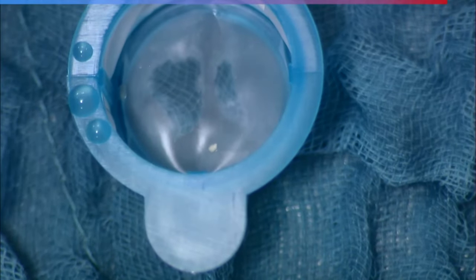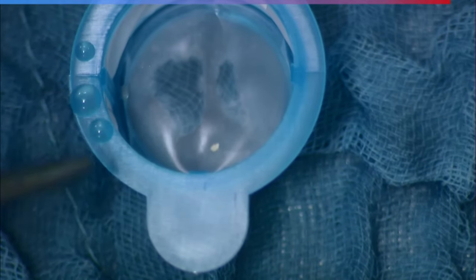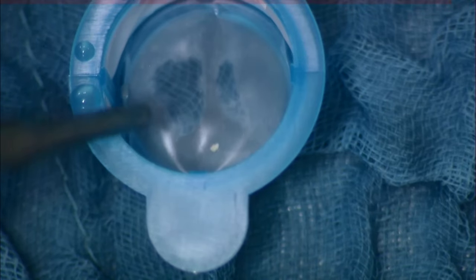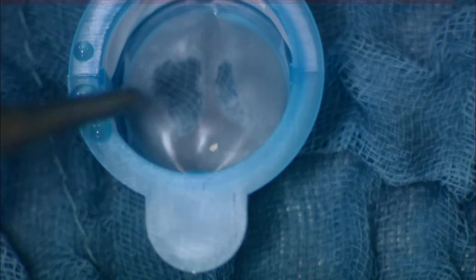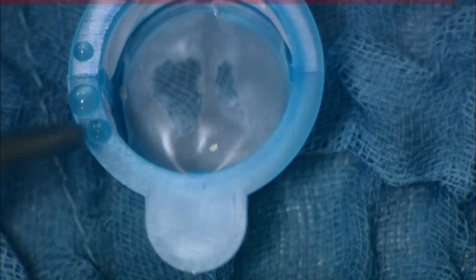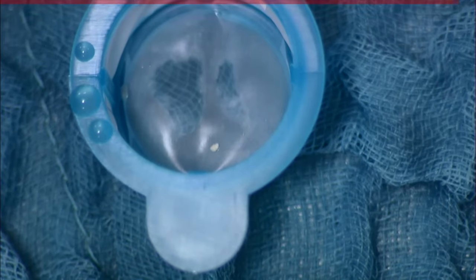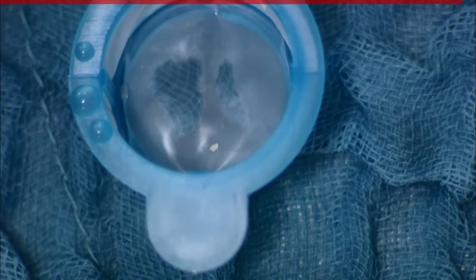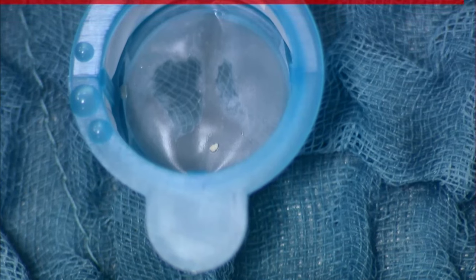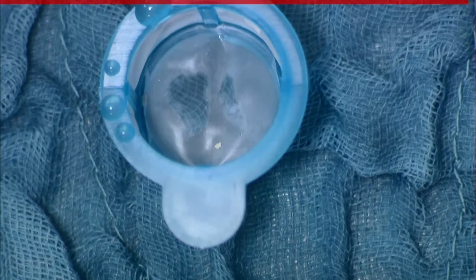And now finally, you can see here what we've captured in the embolic protection device. Not a lot of tissue, but you see here at least one big chunk of whatever this is. It could be calcium, it could be some valvular tissue. It doesn't look to be a thrombus, at least from the color. And you've seen this a lot. It's encouraging to see that we've captured something. This was in the left carotid artery. So it was in the filter that was placed in the left carotid artery. So we're happy that we fished this out.